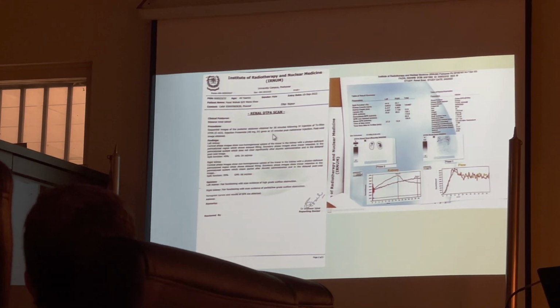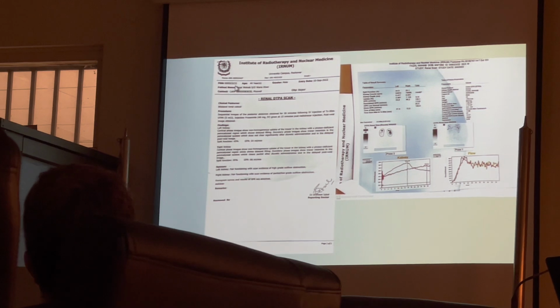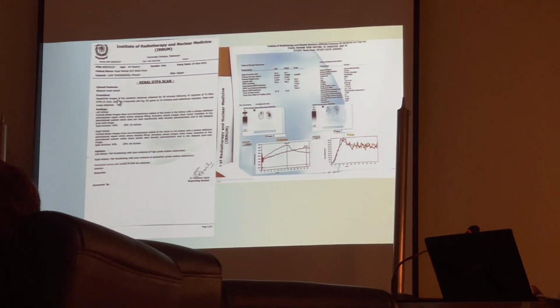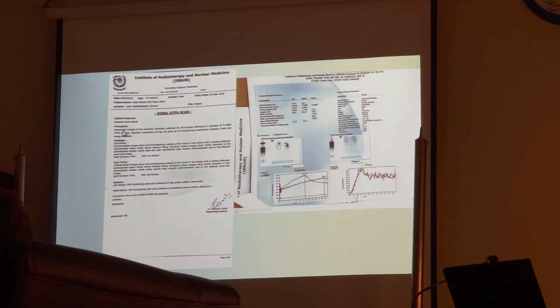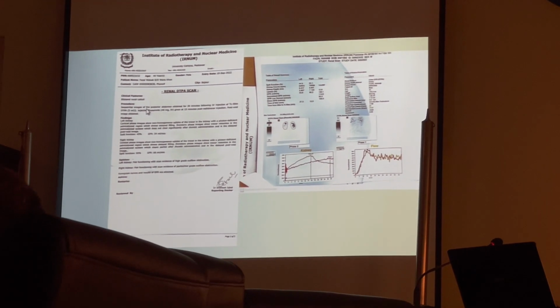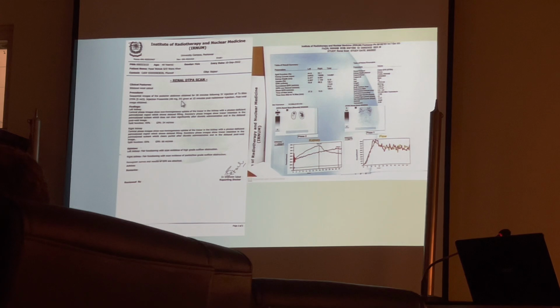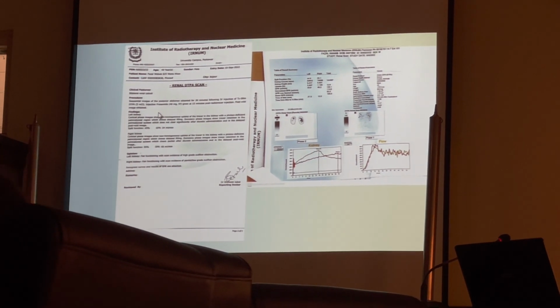This is a sample of a DTPA scan. It is labeled here with the MR number, age, name of the patient, contact number and address. Now here the procedure is mentioned. Sequential images of the posterior abdomen were obtained for 30 minutes following the IV injection of technetium labeled DTPA, and furosemide 40 mg was given at 15 minutes post radiotracer agent. Post-void images are obtained.